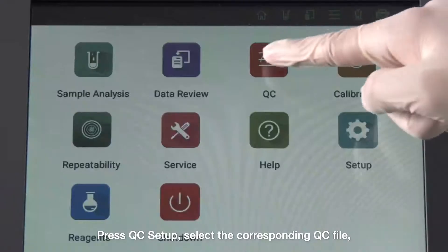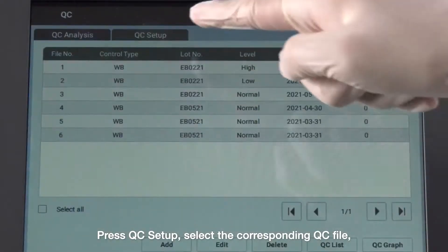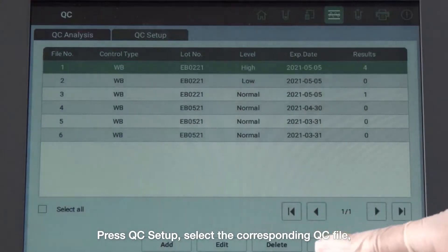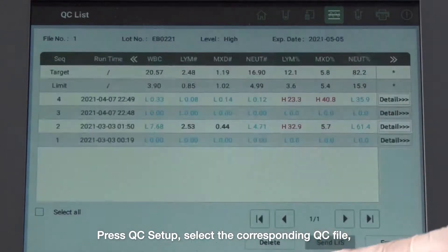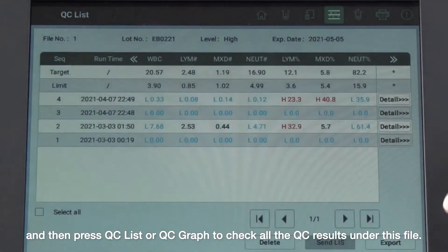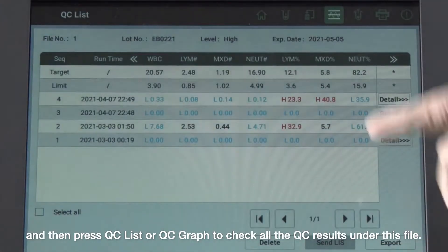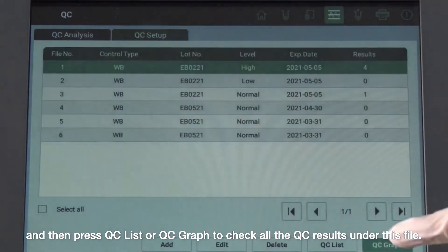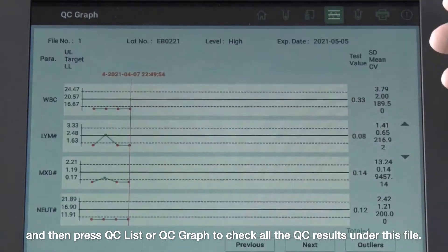Press Quality Control Setup and select the corresponding quality control file. Then press Quality Control List or Quality Control Graph to check all the quality control results under this file.